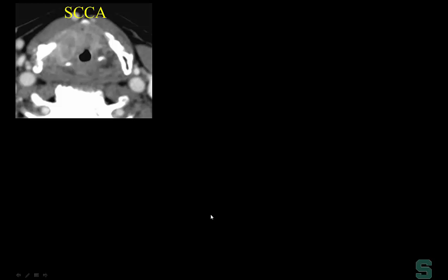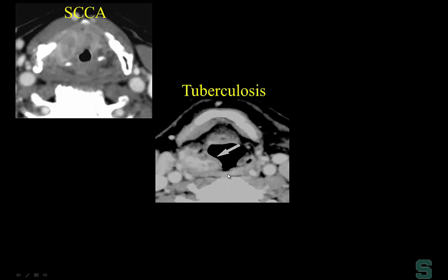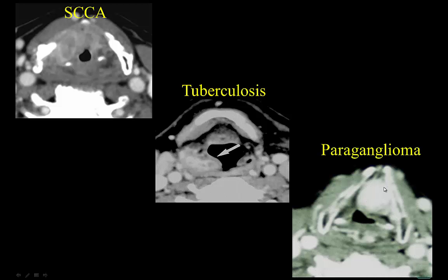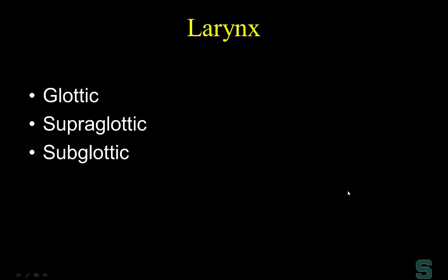One lesson in radiology is that imaging manifestations can be protean. This is a pathologically proven case of tuberculosis that could easily be mistaken for squamous cell carcinoma. On the other hand, this densely enhancing mass is a submucosal paraganglioma — an unusual case with a different appearance that tips you off to a highly vascular lesion. Now let's talk anatomy.